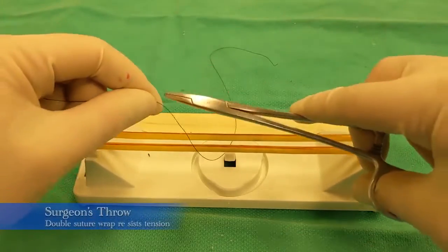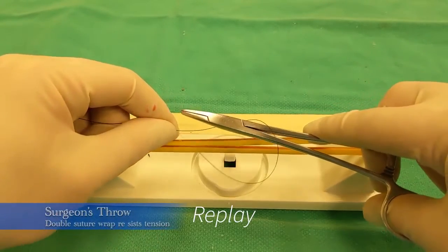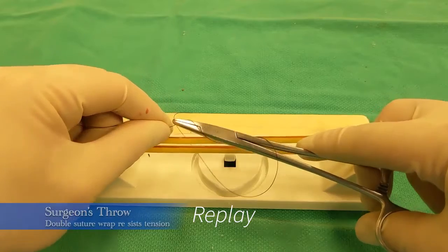Most simply, you can increase friction by starting with a surgeon's throw. To perform a surgeon's throw, the suture is wrapped around the instrument twice, rather than once, and tightened.